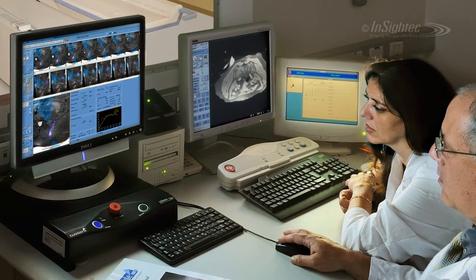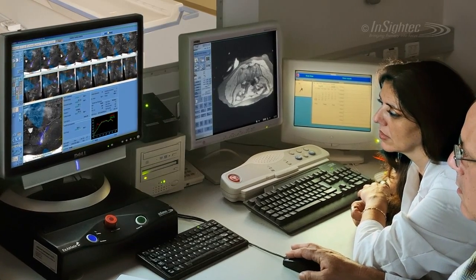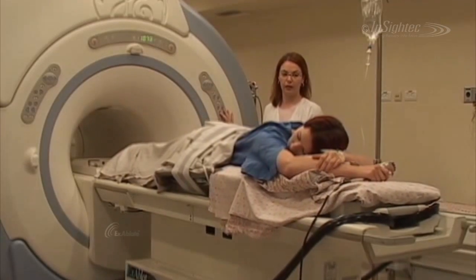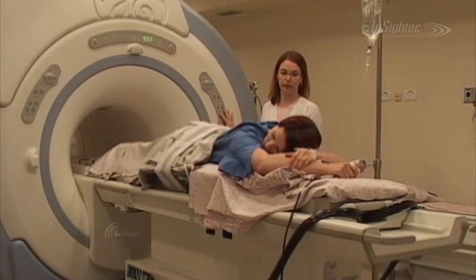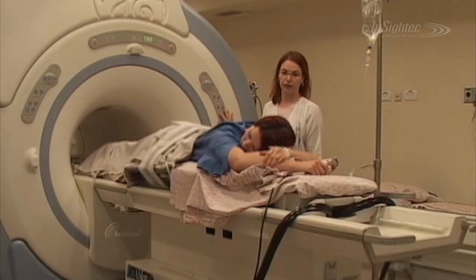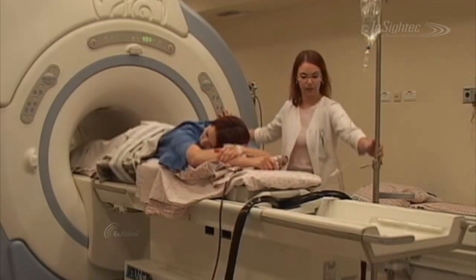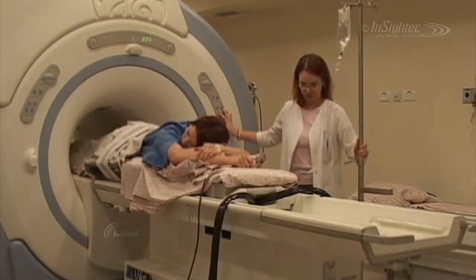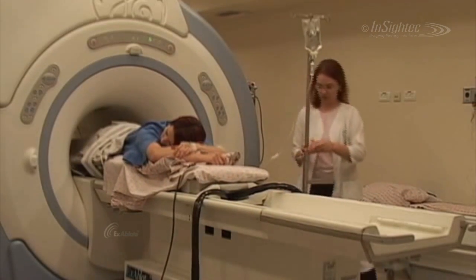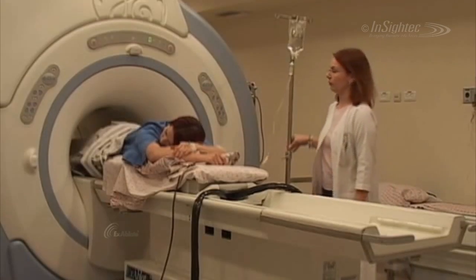Treatment planning and the entire treatment are conducted from the Exablate workstation. The patient lies on the Exablate table inside the MRI with the targeted lesion positioned above the transducer. The patient is prepared with an IV to deliver medication and MR contrast. Anesthesia is used for patient comfort according to hospital guidelines.